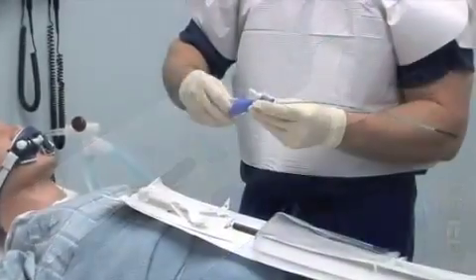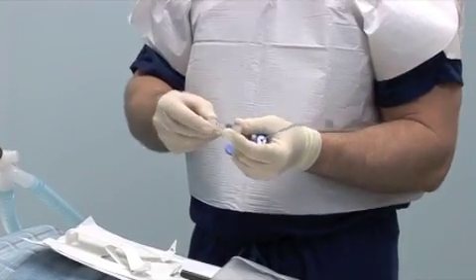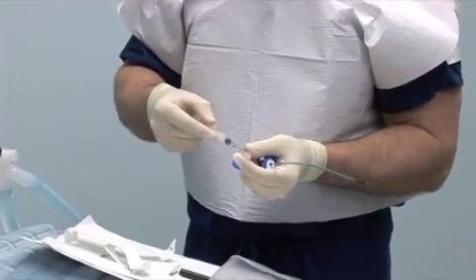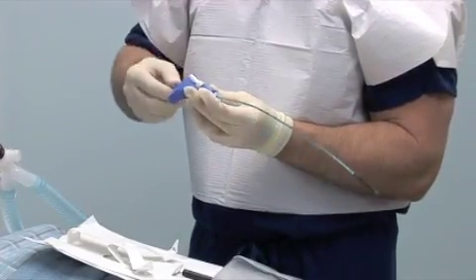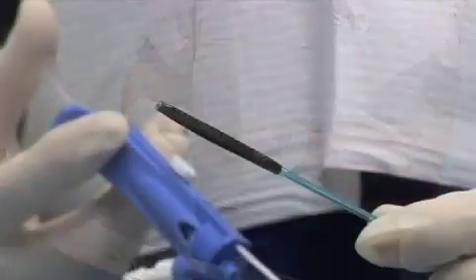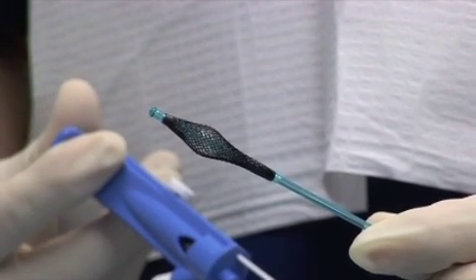Remove the syringe from the slot in the handle by unscrewing it from the luer lock. Fill the syringe with three cc's of air and relock it within the slot in the handle. Slowly test inflate the balloon once to check for leaks, then allow the balloon to passively deflate.